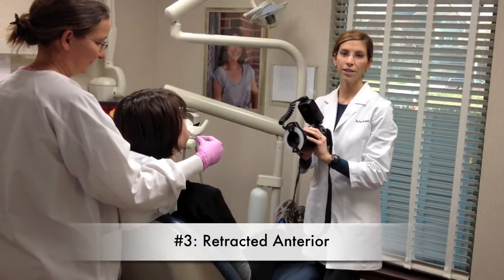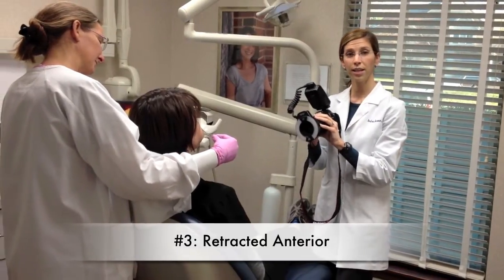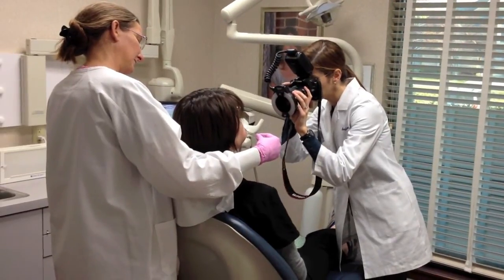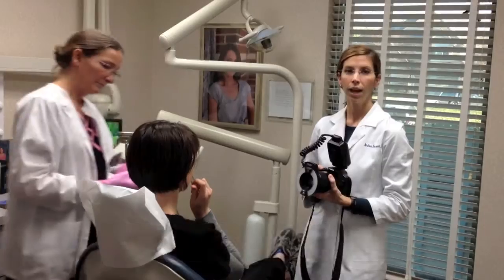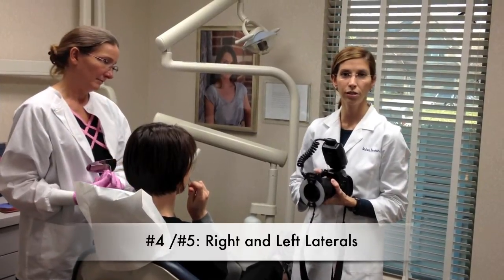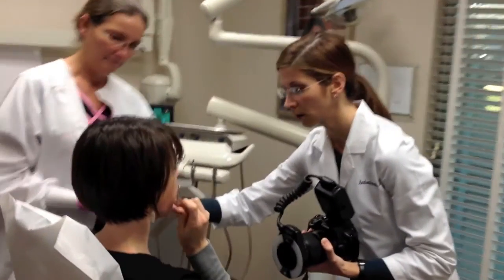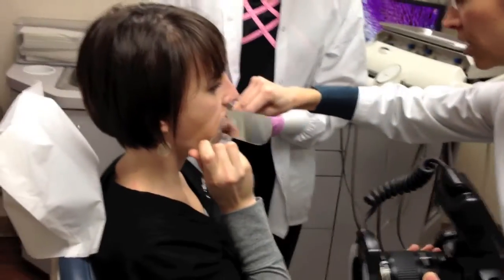For the next photo, I have my assistant put retractors in so that I can capture the upper and lower teeth slightly apart. Next, I take right and left lateral shots. To do this, my patient holds a retractor and we put a mirror that's been dipped in warm water in between her cheek and her teeth.